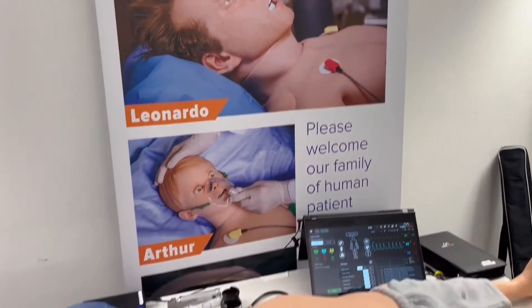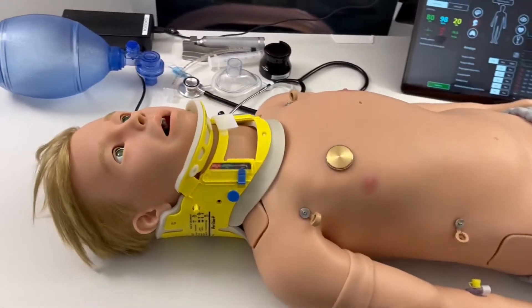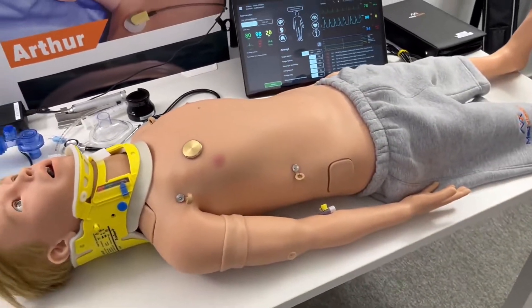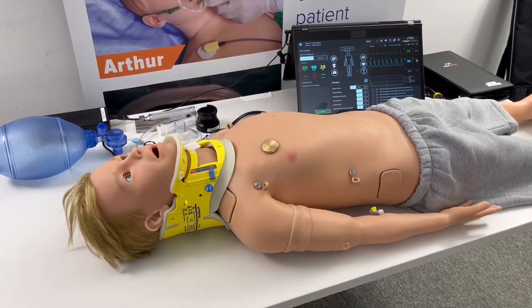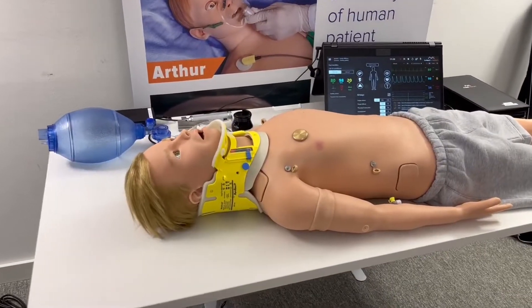Hello everyone, today I would like to show you the new generation of Arthur, our pediatric patient simulator by Med Vision. I'll tell you what's new about him and what improvements have been made. However, this is a pre-production unit so the final spec might be a little bit different, so stay tuned to find out about that.